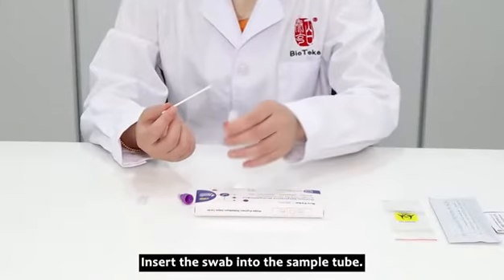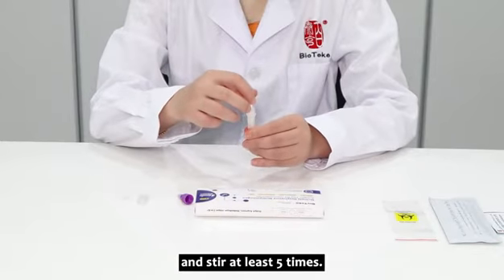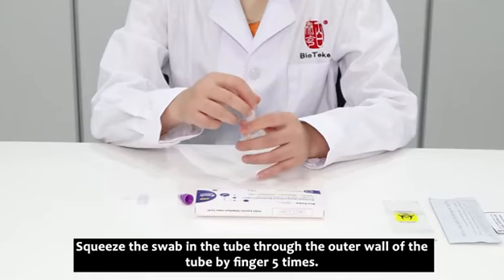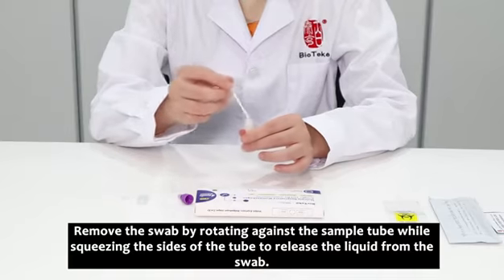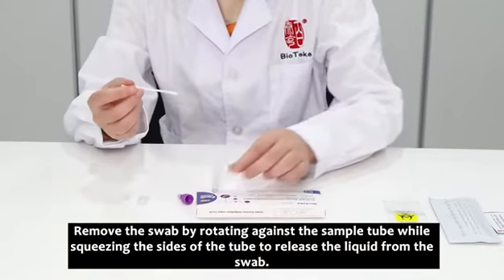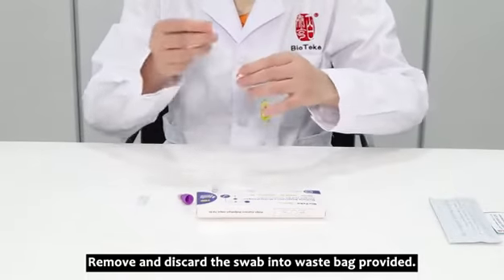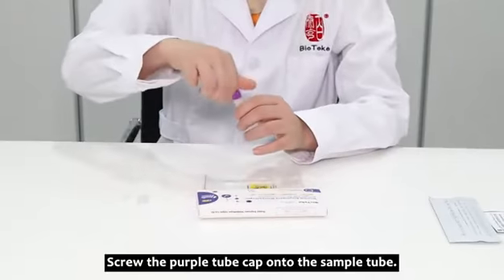Insert the swab into the sample tube, touch the bottom of the tube with the swab tip, and stir at least five times. Squeeze the swab in the tube through the outer wall five times. Remove the swab by rotating against the sample tube while squeezing the sides to release the liquid. Discard the swab into the waste bag provided.